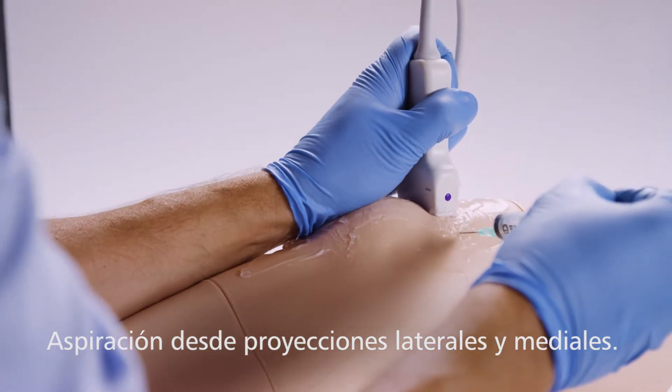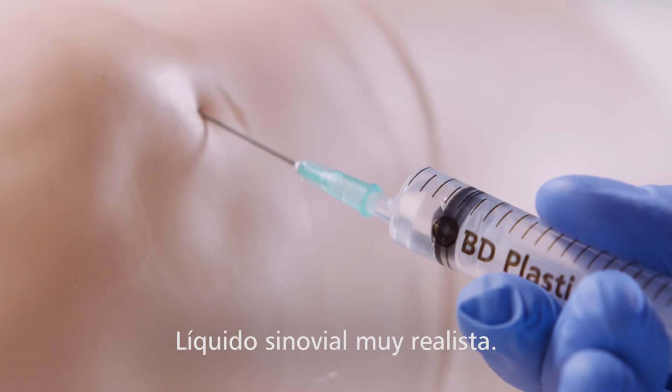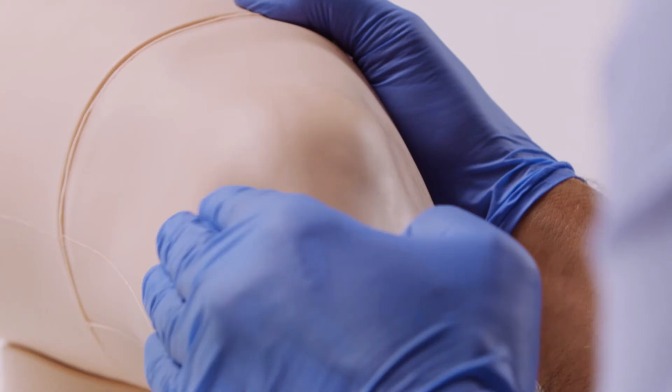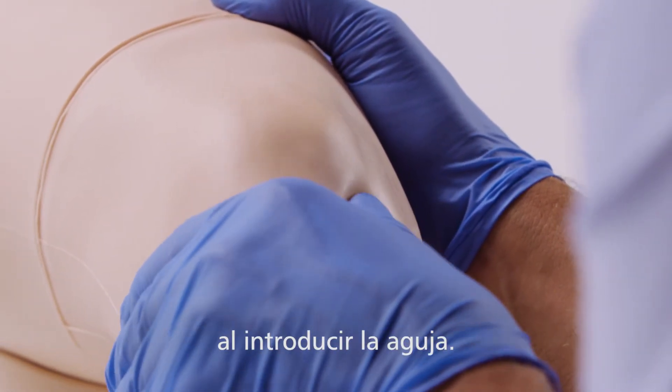Aspiration can be performed from both the lateral and medial aspects. The synovial fluid removed has a realistic color and consistency. The model has synthetic skin, muscle and fat layers for a realistic tissue response when performing an injection.